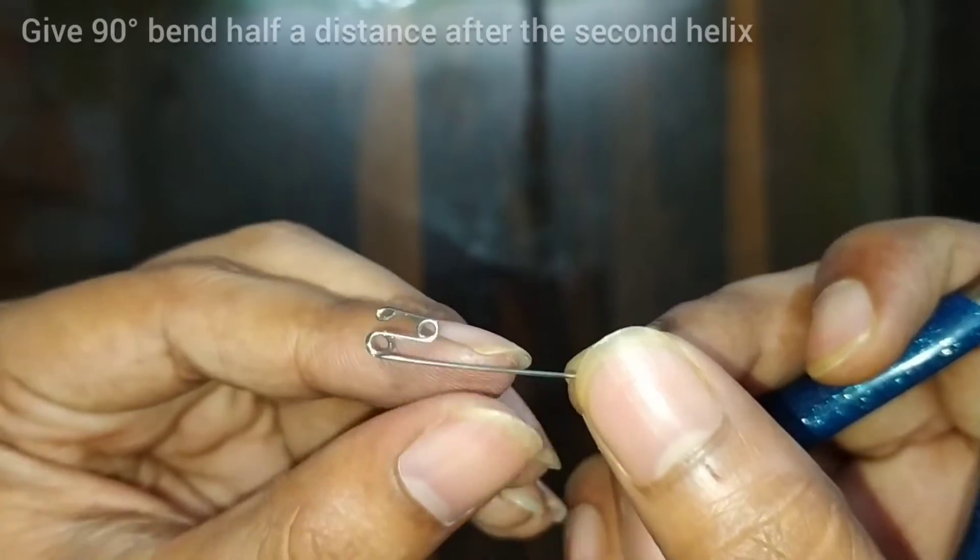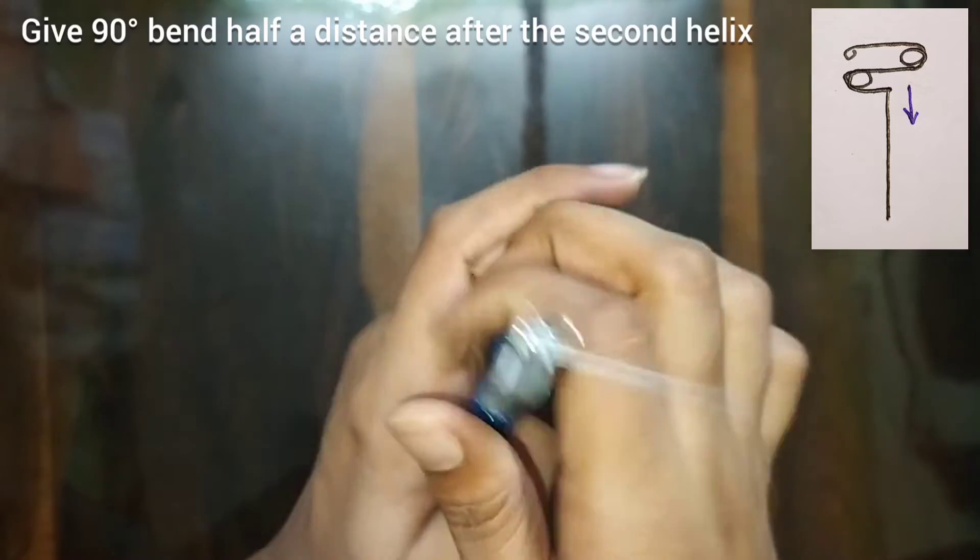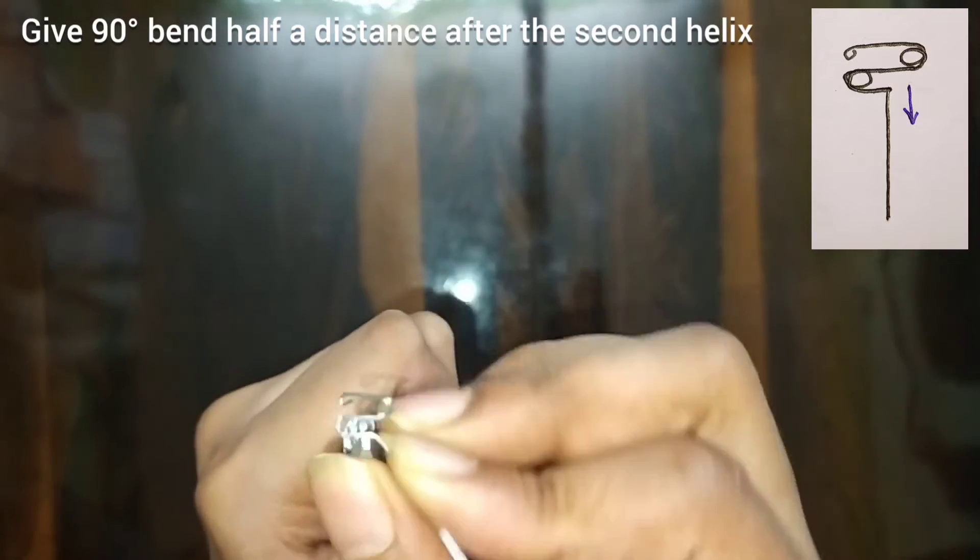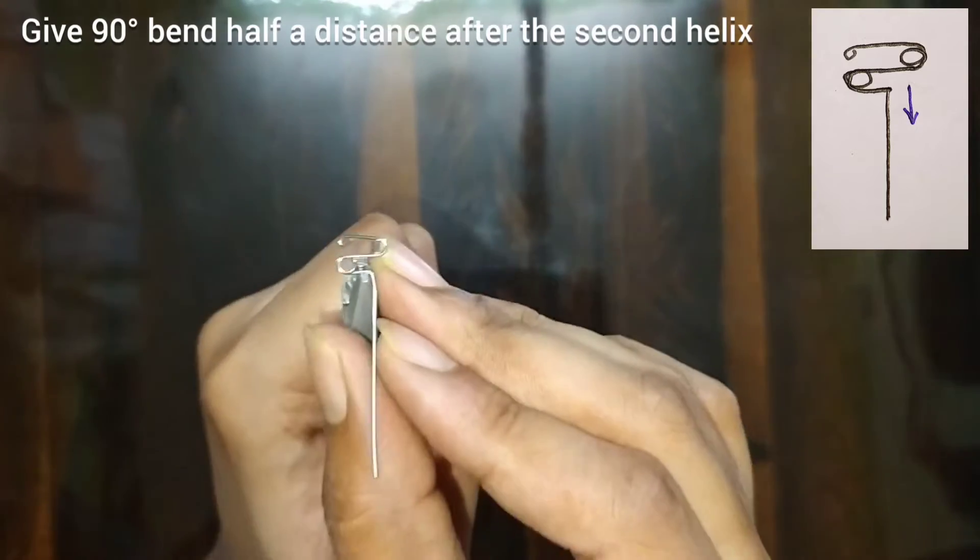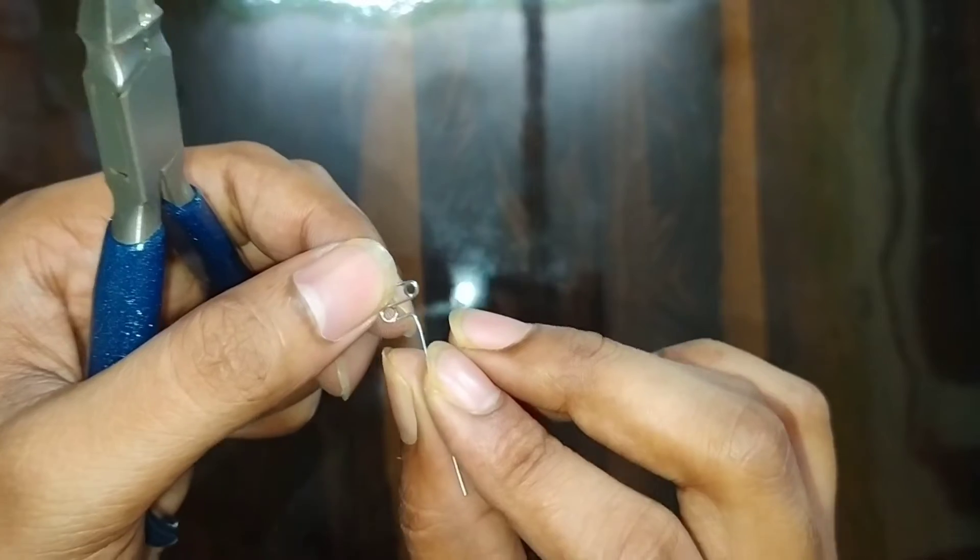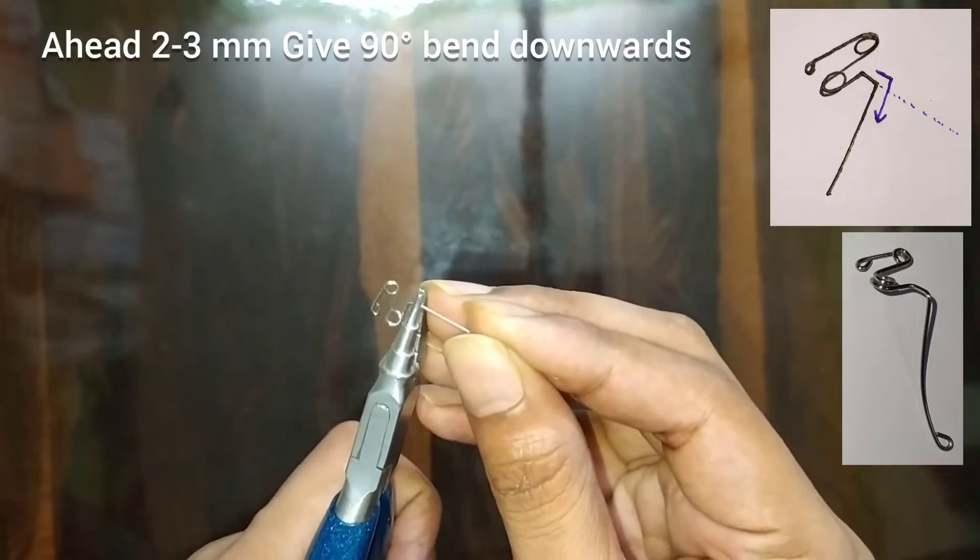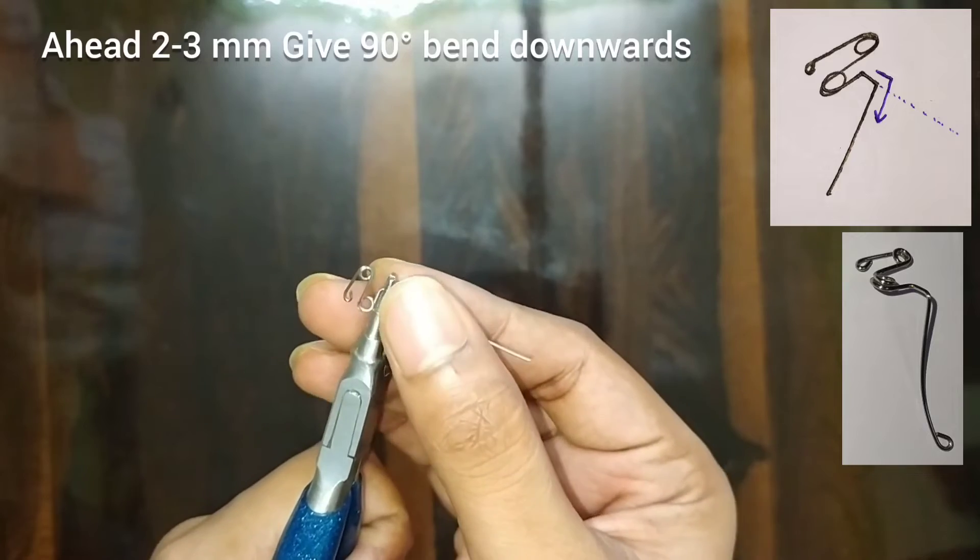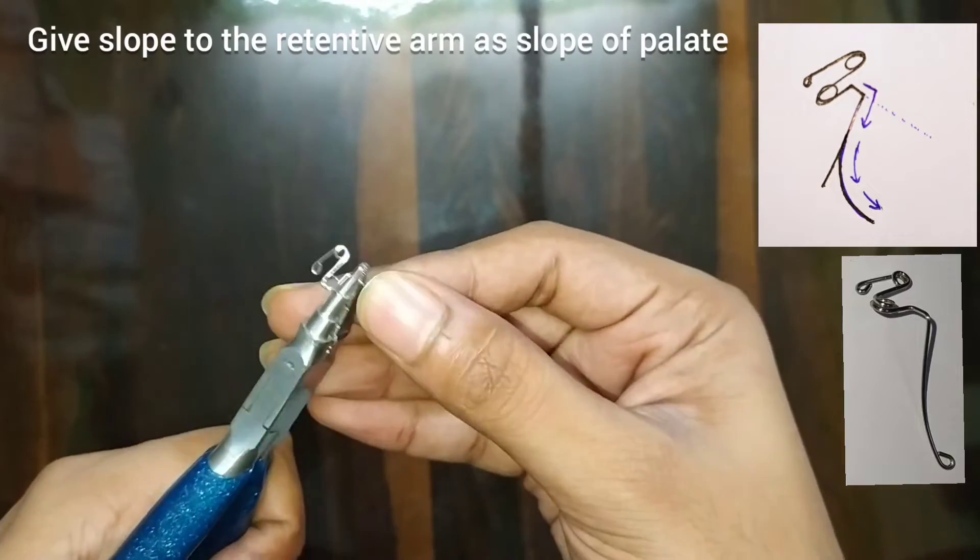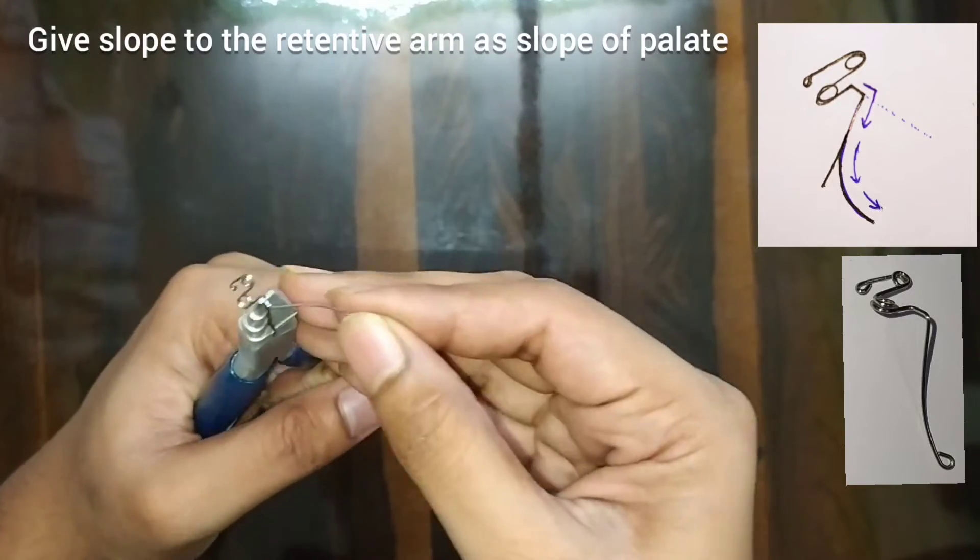After this, at the middle of the mesial distal width of the tooth, give a 90 degree bend. The bend should be in the same plane. Then again give another bend downwards, just 2 to 3 mm ahead, and then make the retentive arms looping.